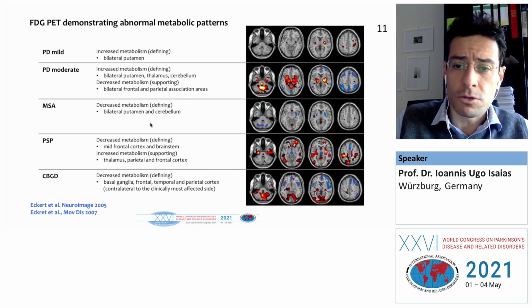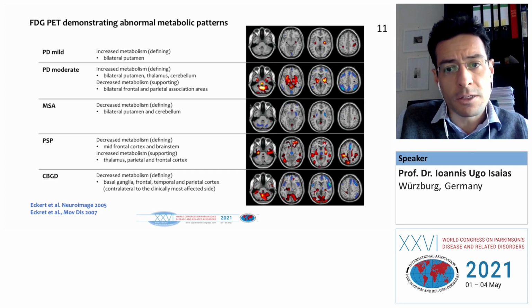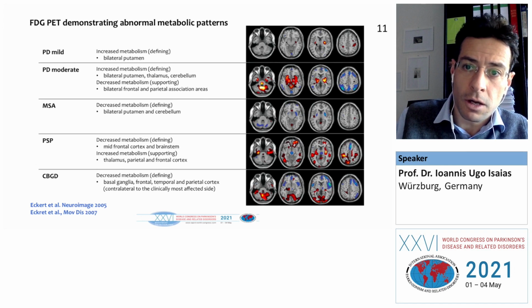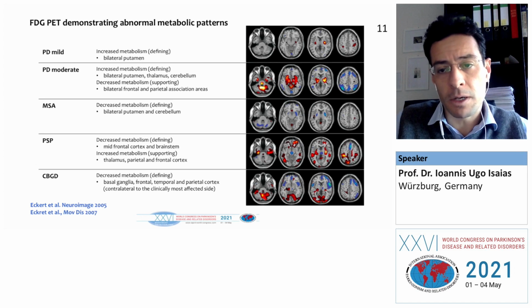Multisystem atrophy is also important, as it is quite a dramatic atypical parkinsonism, and it's quite important to distinguish it from Parkinson's disease, and it's difficult, especially in very early stages. In this case, instead, we have a reduced putaminal glucose uptake, which is the opposite of the picture we can see in Parkinson's disease. And this was quite an early finding and quite reliable also in my experience.